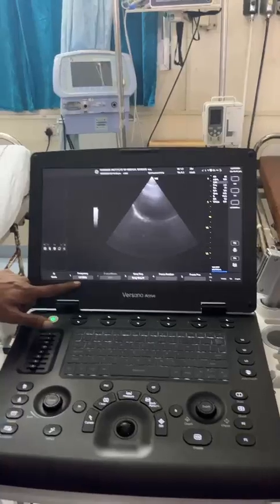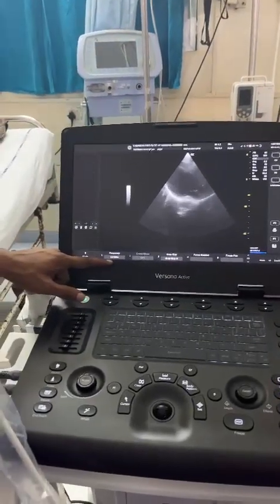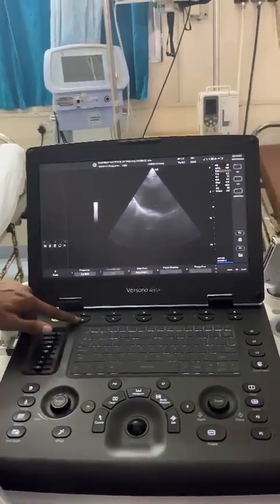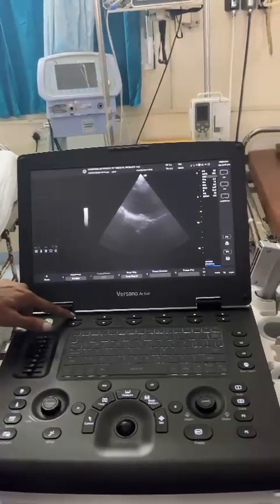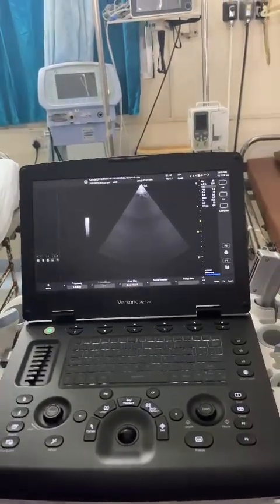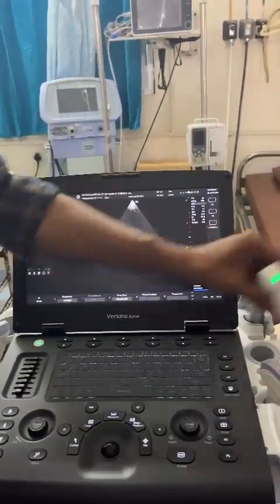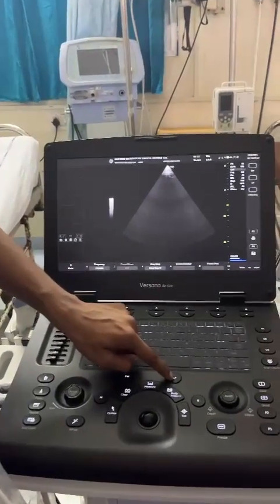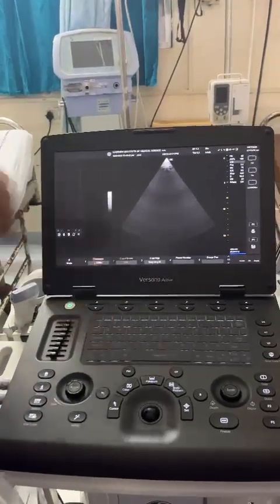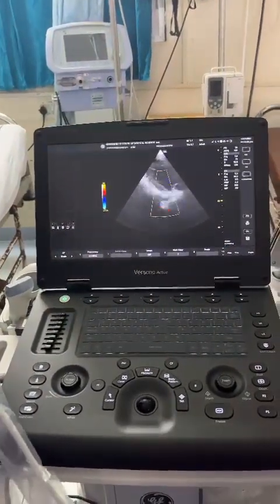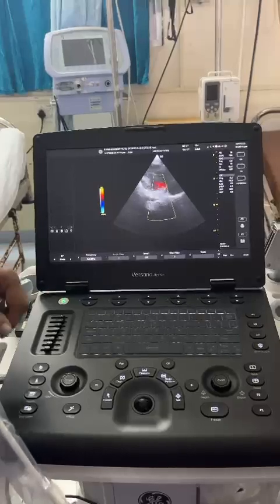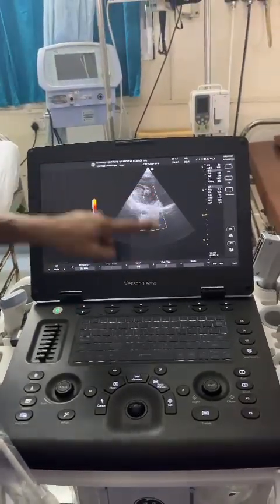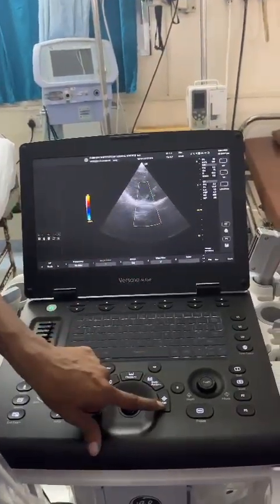This is our frequency. For different patients, for different penetration, you can adjust it up and down. You also have a color flow here. If you want to increase the color flow box size, press the select button.